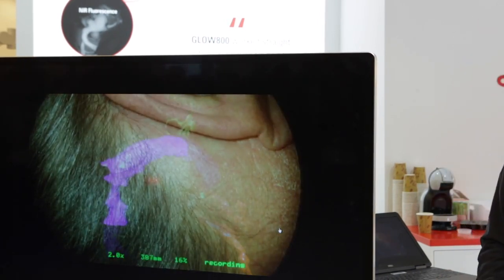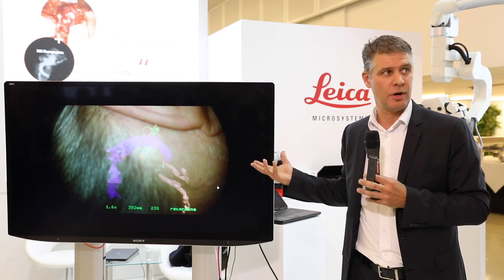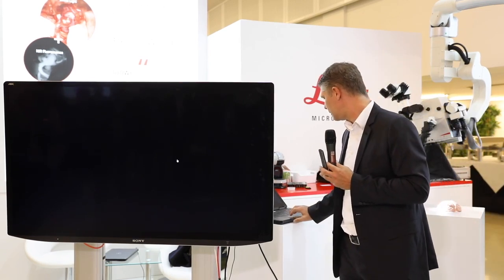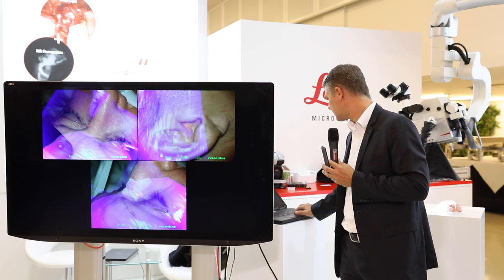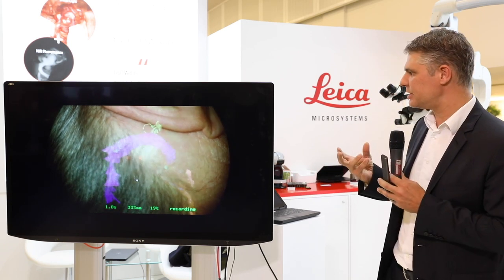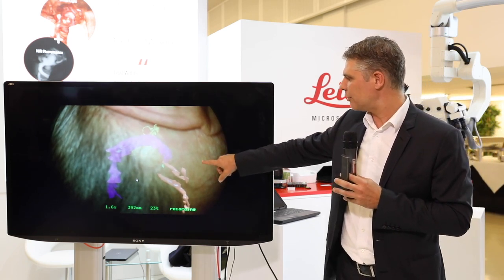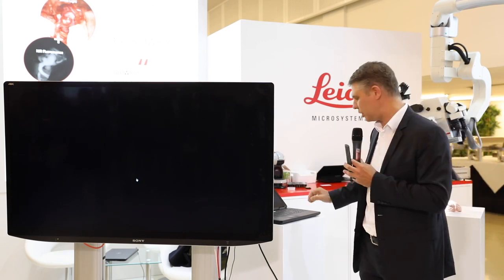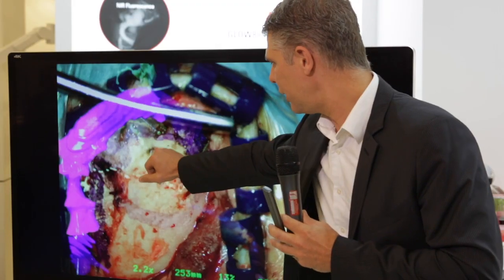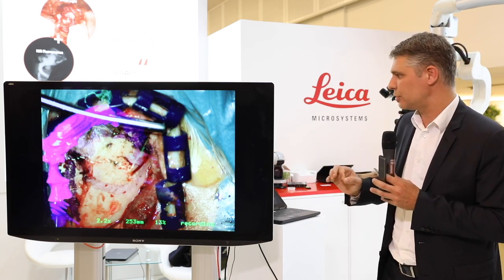This is a posterior fossa case. When you see it through the microscope the experience is different — it is designed not to disturb the surgeon, so it's very faint but very comfortable. Here is the transverse sinus, the vertebral artery, and the green point is the place where we will open the arachnoid. We adjust to the bone — there is a hole here and the mastoid suture, which was segmented prior to surgery and now we realign it, making sure the sinus is where we expect it.